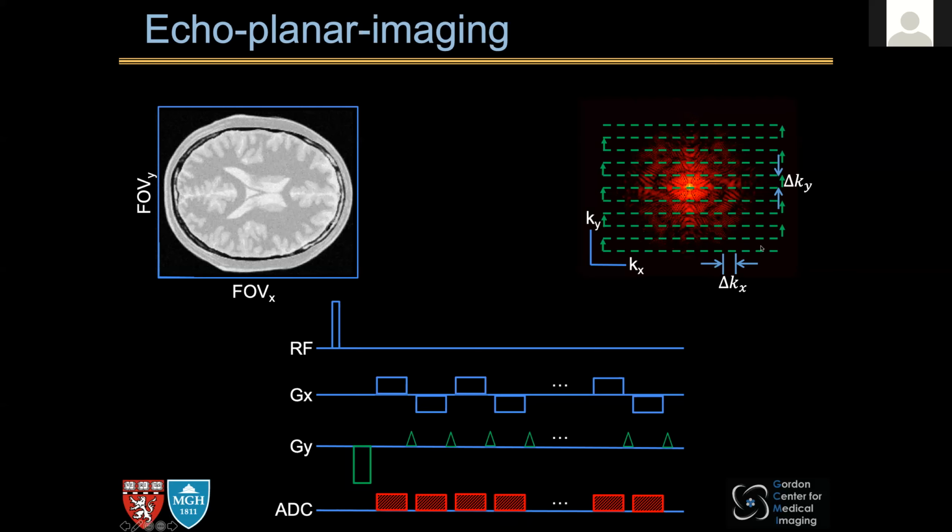So in K-space, we acquire K-space lines from right to left, then jump to another K-space location in the y direction, and then acquire frequency encoding data from left to right, and so on and so forth. If you're aggressive, you can acquire the entire K-space in this fashion using one repetition time. By doing this, we can significantly reduce the acquisition time for MR.